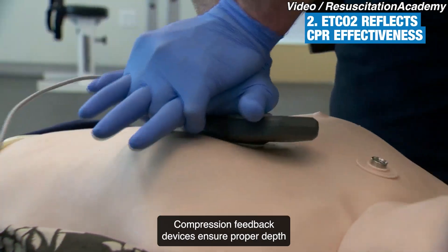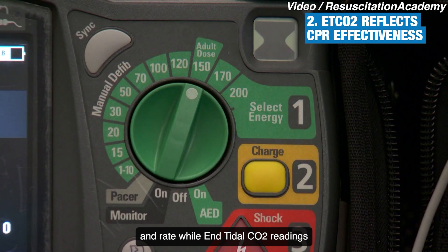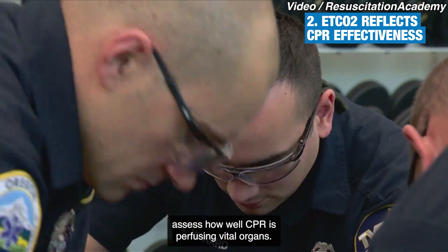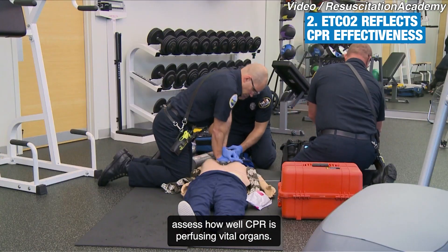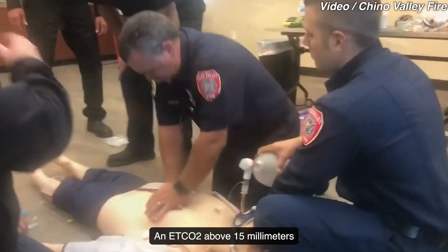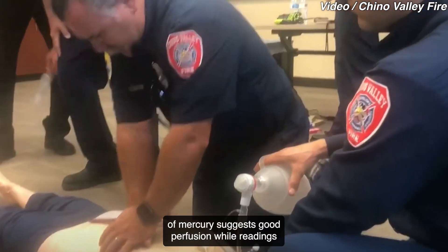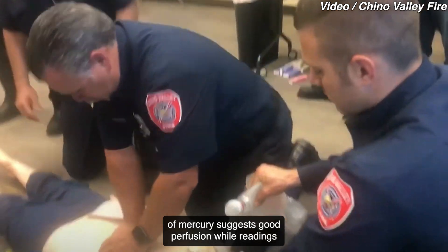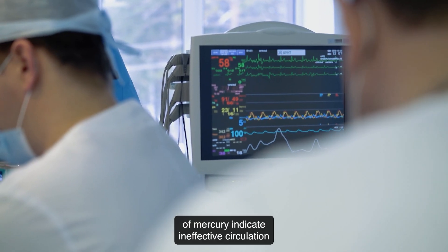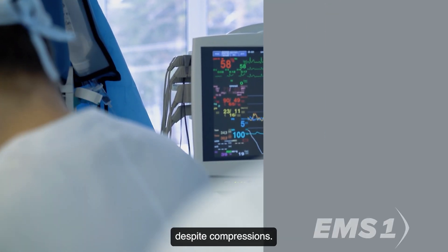Compression feedback devices ensure proper depth and rate, while end-tidal CO2 readings assess how well CPR is perfusing vital organs. An ETCO2 above 15 mmHg suggests good perfusion, while readings below 10 mmHg indicate ineffective circulation despite compressions.